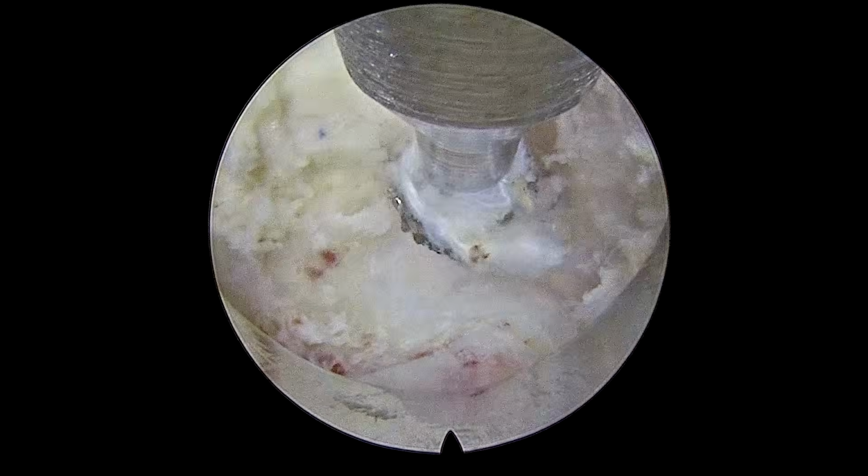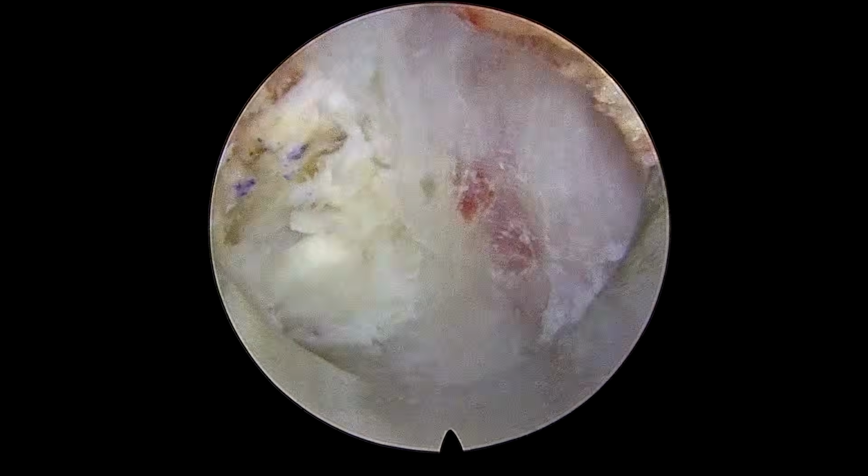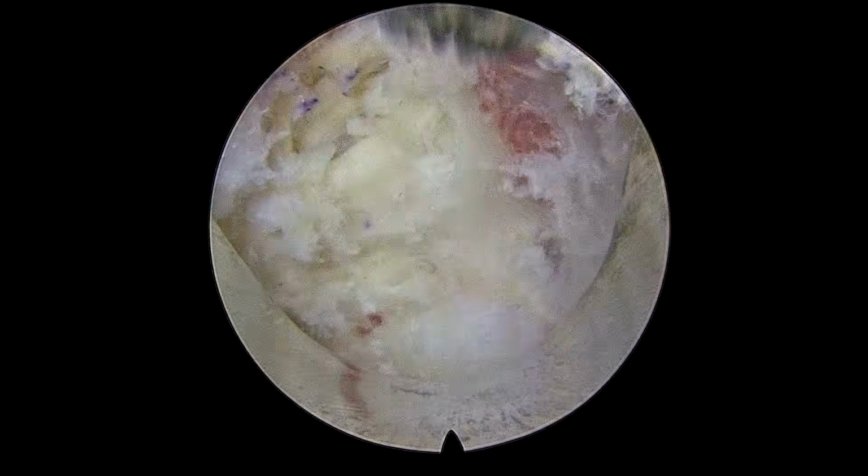Here you have to be very careful while using the burrs. These are very sharp instruments and sometimes it slips and goes inside the epidural space. So yes, you have to be very careful while using the burrs. Keep your hand steady.